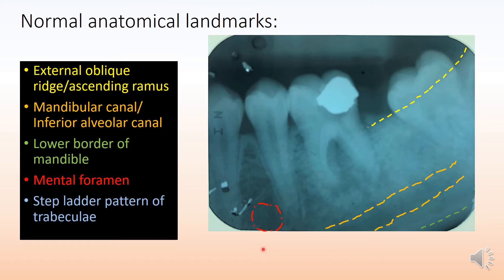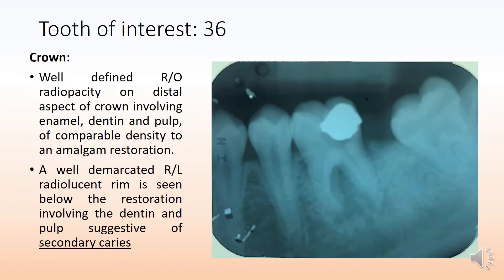You also see a step-ladder pattern of trabeculae, which is again very typical of the mandibular molar region. Moving on, let's look at the tooth of interest. Visibly, we can see that the one particular tooth of interest is the 3-6.